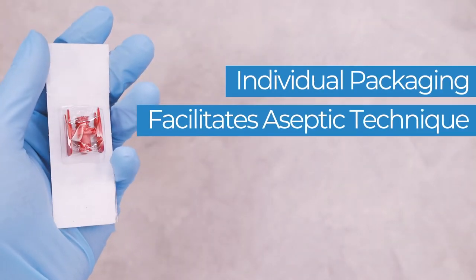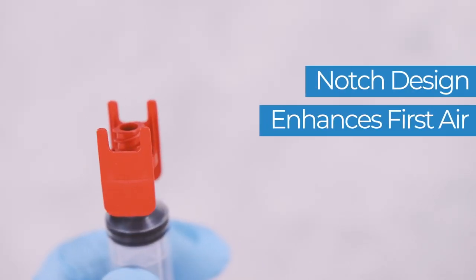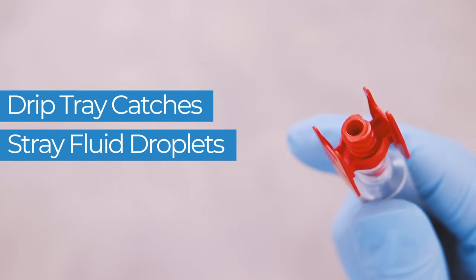Individual packaging facilitates aseptic technique. The patented notch design enhances first air over the connection port, and the built-in drip tray design captures stray fluid droplets.